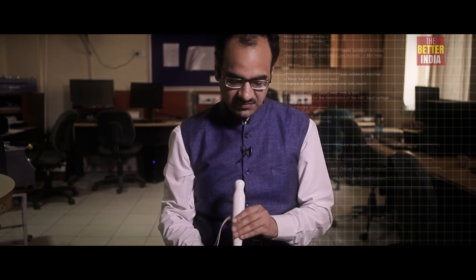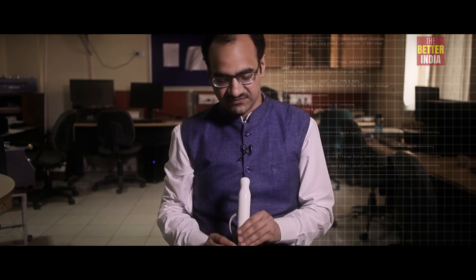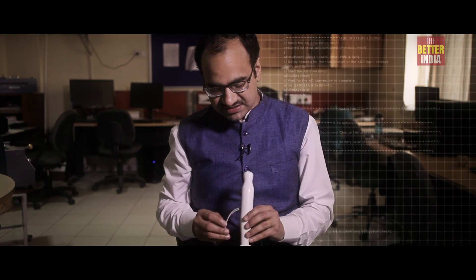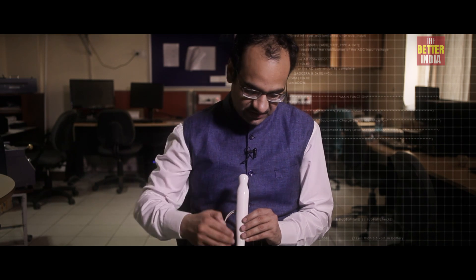The SmartCane device fits on the top fold of the traditional white cane. It has an ultrasonic transmitter-receiver system, which projects an ultrasonic beam that gets reflected from obstacles in front, giving an indication of the distance. This distance information is provided through varying vibration patterns produced on the grip.